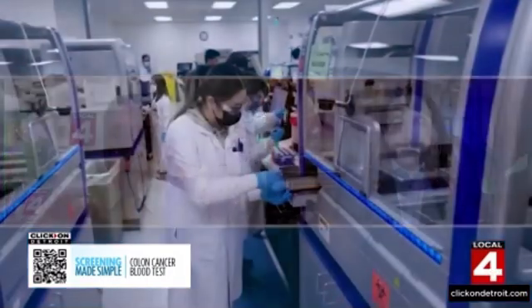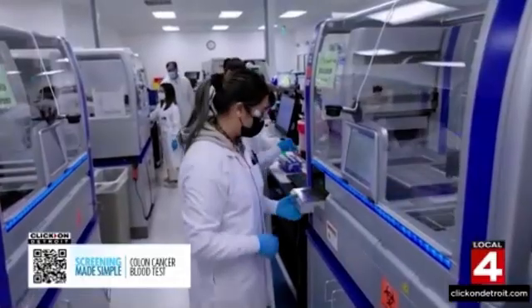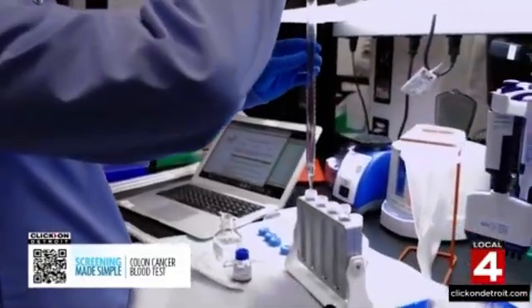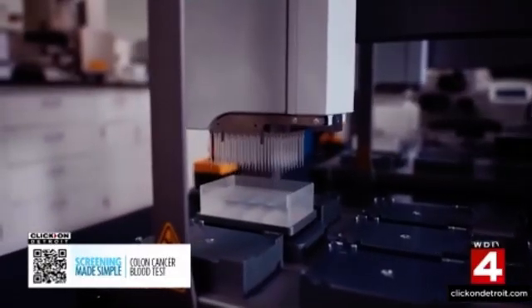This is a blood test looking for colon cancer. What is it exactly measuring in the blood that identifies the potential for colon cancer? Yeah, what it does, which is really powerful, is it takes the blood and it looks for tumor DNA. And if it can find tumor DNA, and it's specifically looking for colorectal cancer tumor DNA, then it makes a positive call. Because as you know, we shouldn't have any of that DNA in our blood. And so if it doesn't, it's a negative. And if it does, it's a positive.